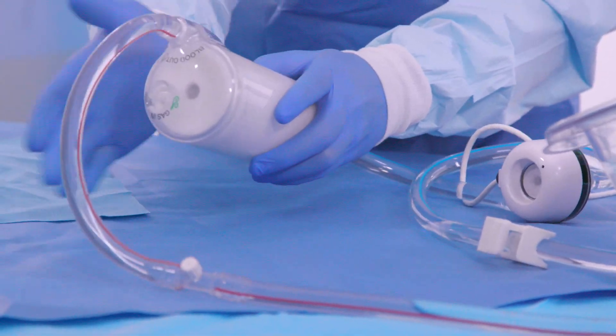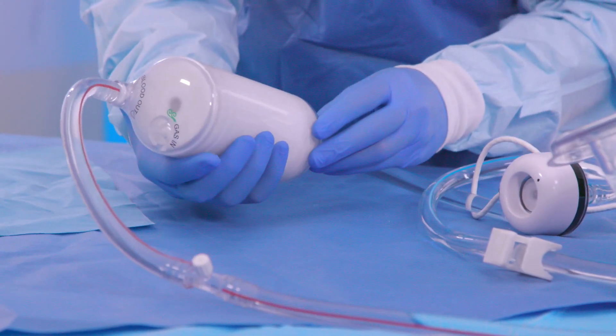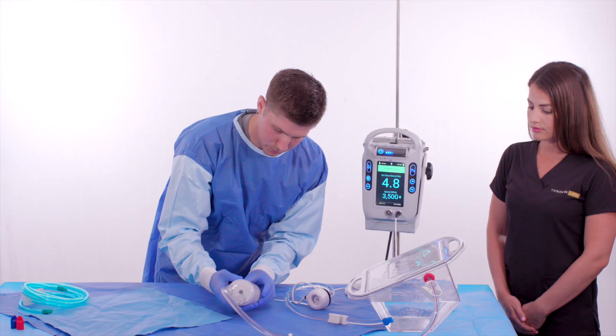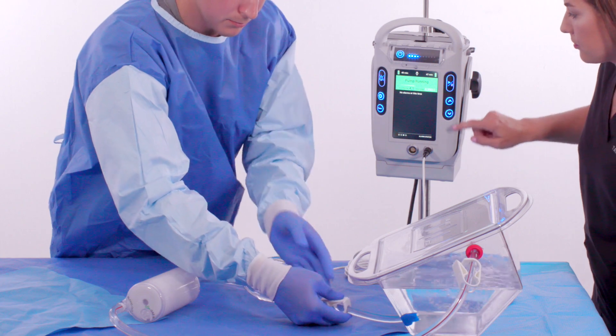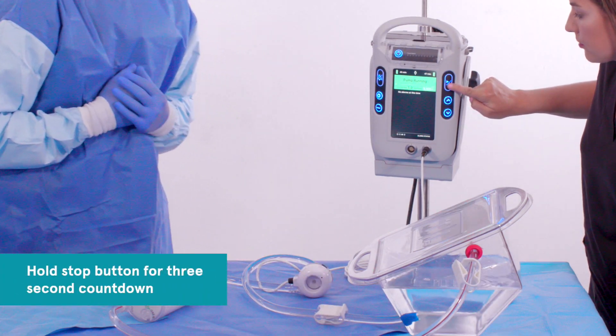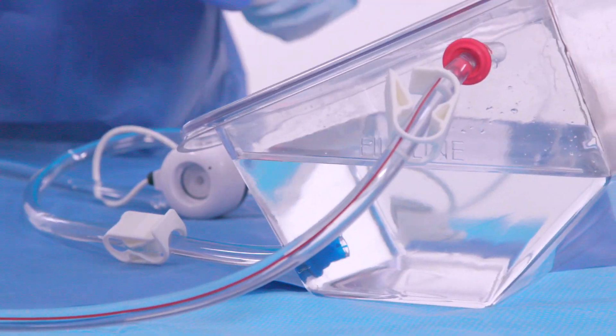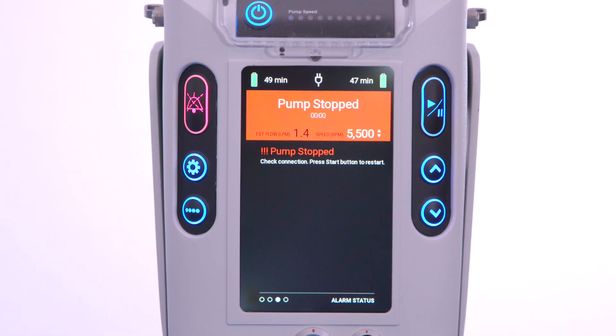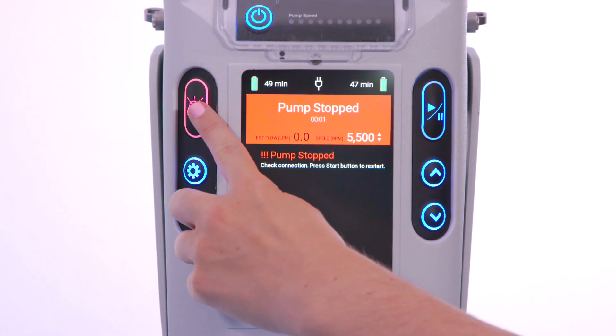The non-sterile operator stops the pump once satisfied that all air has been removed from the circuit, and the sterile operator clamps the inflow and outflow tubing. The non-sterile operator may press the alarm silence button to mute any alarms.